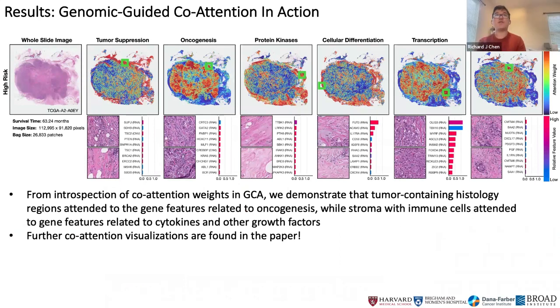Yeah, so Fayez, for this work, we had 2 board certified pathologists go in and introspect close to 50 to 100 of these co-attention heat maps, in a similar way to how PORPOISE was done. With PORPOISE, we asked 2 board certified pathologists to look at every single interpretability heat map across the 6,000 patients, across all 5 folds. We didn't do something at that scale for MCAT, but we did look through 50 to 100 cases.